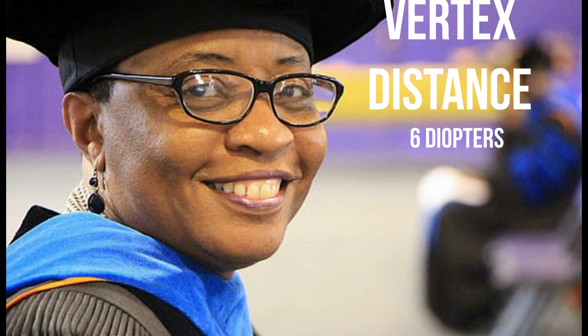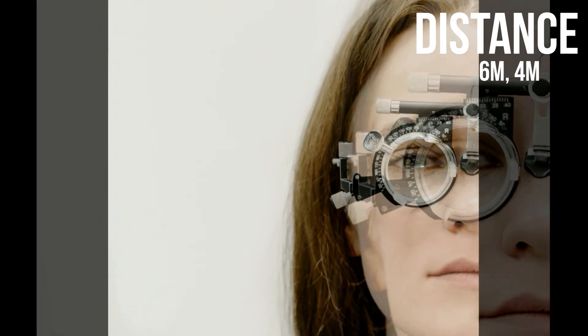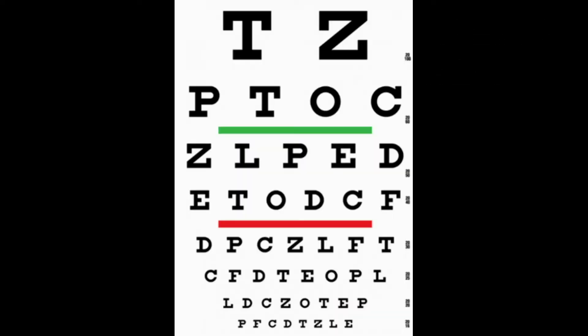The vertex distance is the distance between the cornea and the back of the lens. The patient should be seated at six meters from the Snellen chart, or at about four meters, depending on the chart that you're using. These distances may vary depending on your chart. Make sure the room is well lit and then fit the trial frame to ensure that everything is comfortable.